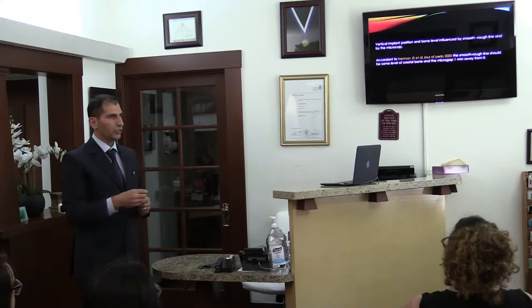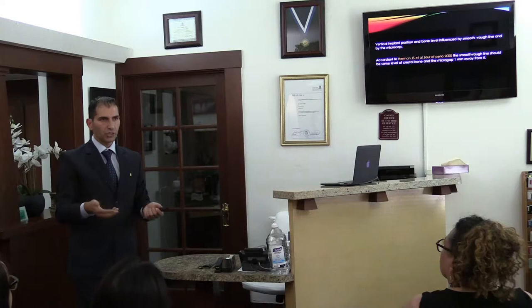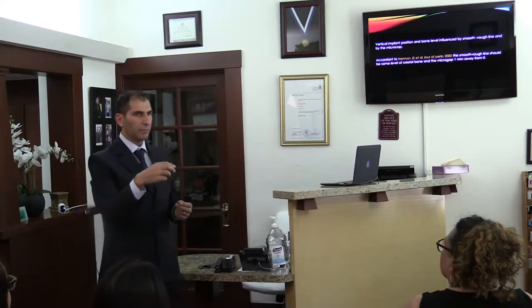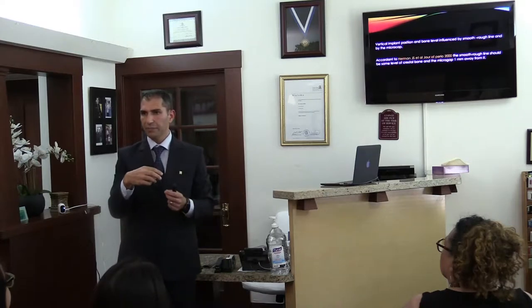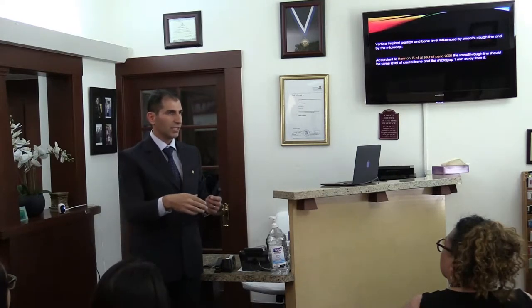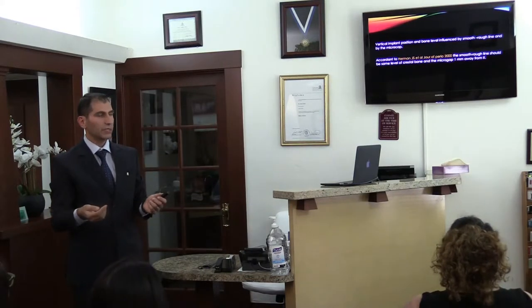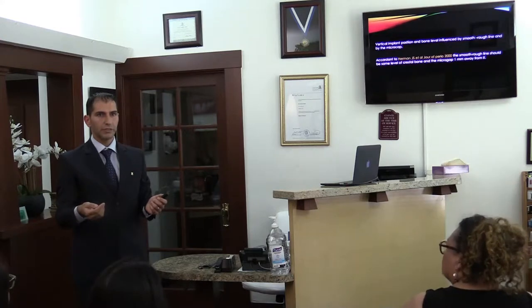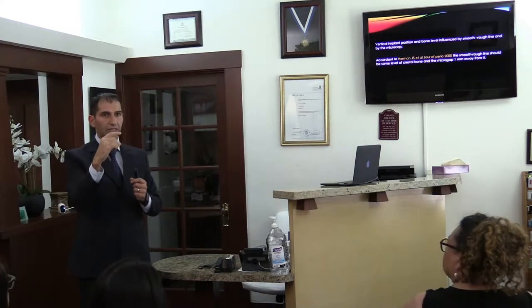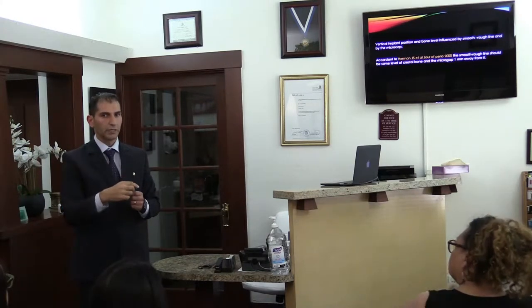I want to move on to the position of the dental implant, because as a restorative dentist and also as a surgeon, we want to understand where we're going to place the implant. Are we going to place the implant bone level, tissue level, subcrestal? We now have a lot of dental implants that we place subcrestally, and actually the drill is longer than the implant itself, by 1 millimeter. So it's designed to go subcrestal.